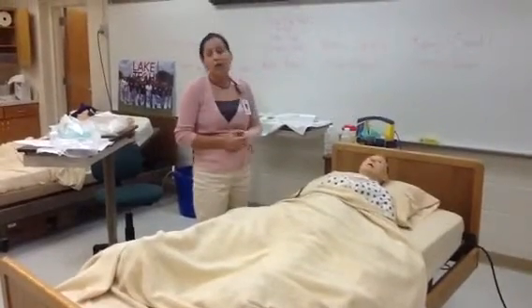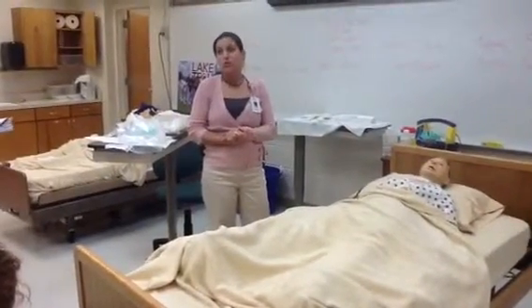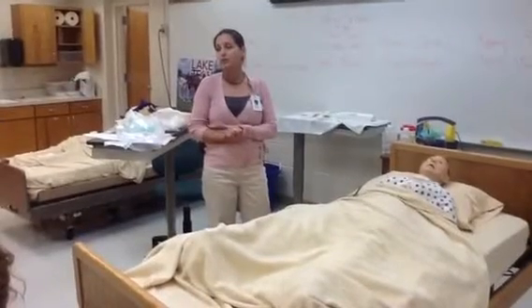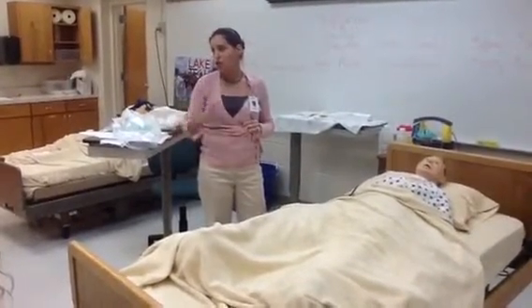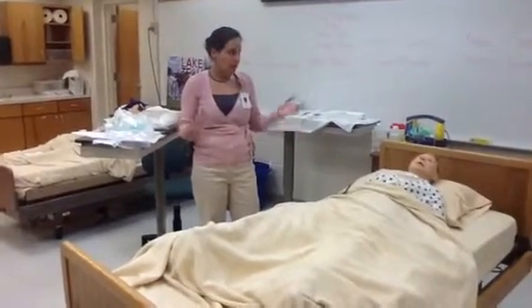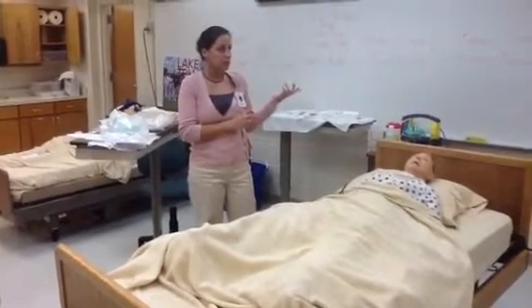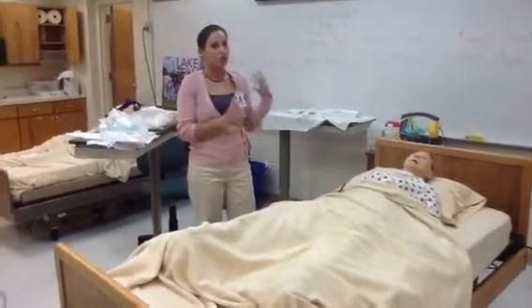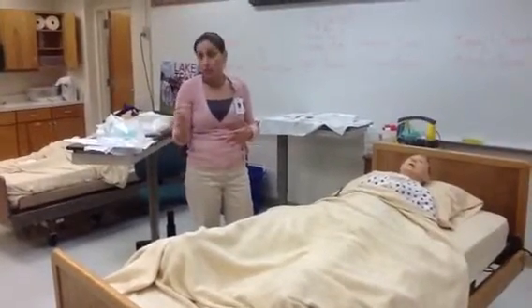Okay? One more thing with your bag. As it's draining, as you approach 800 cc's, you need to clamp off the bag because you can throw somebody into shock if you allow too much urine to come out at one time. We'll learn more about that when we get to the pathophysiology of the disease process of the genitourinary system. But I want you to know right now that 800 in the bag and you have to clamp it off.